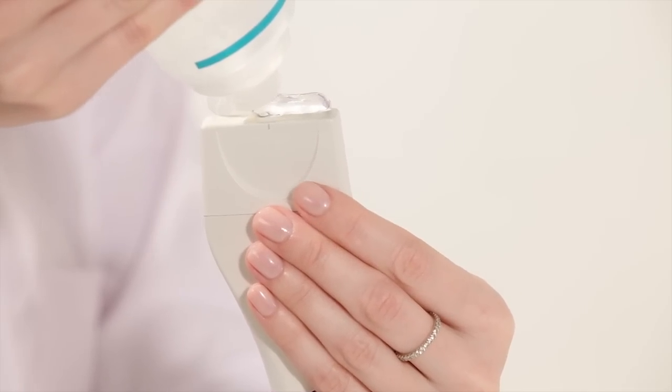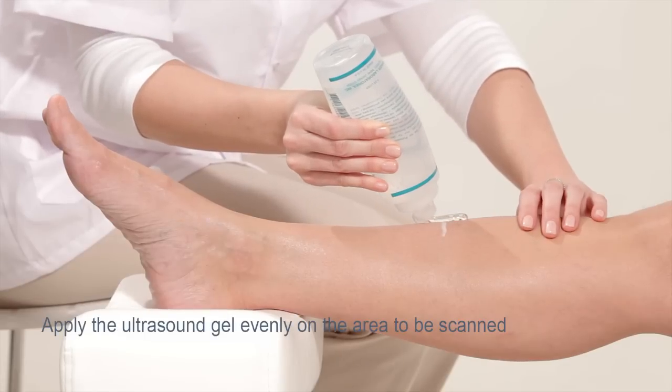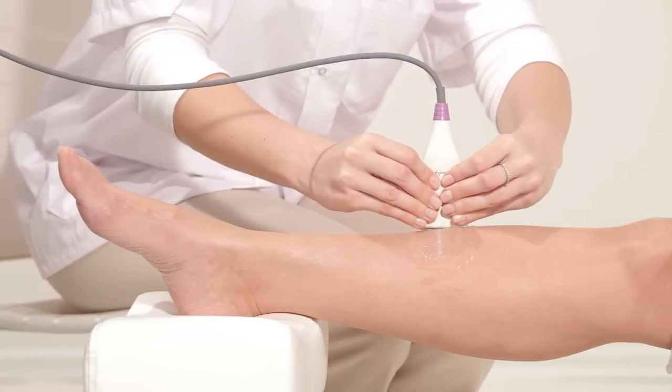Apply a uniform layer of ultrasound gel on the probe and on the leg over the full area of the line. You are now ready to start measurement. Press start to begin scanning.